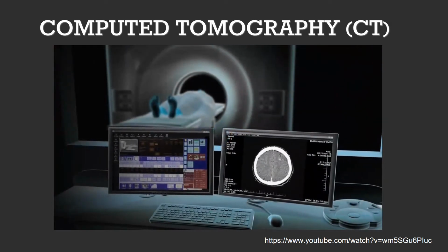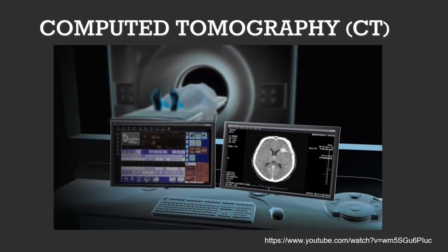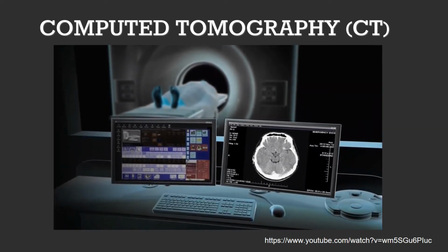For cardiac imaging, the scanner takes pictures in between heartbeats when the heart is still. Therefore, a high heart rate may give blurry images. If your heart rate is too high, a drug may be used to slow it down.